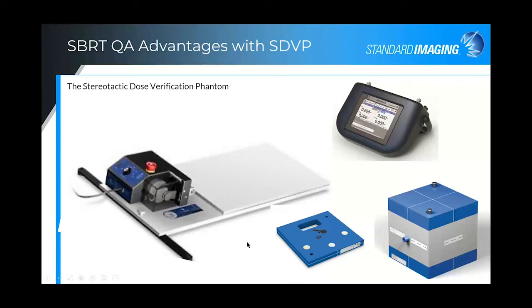Overall, the SRS dosimetric QA insert provides complex geometric targets with bone equivalent density material to evaluate image avoidance and inclusion components of the treatment planning system. The volumes of the test objects are known and can be used to evaluate the volumetric accuracy of the treatment planning system, as well as independent CT density checks.